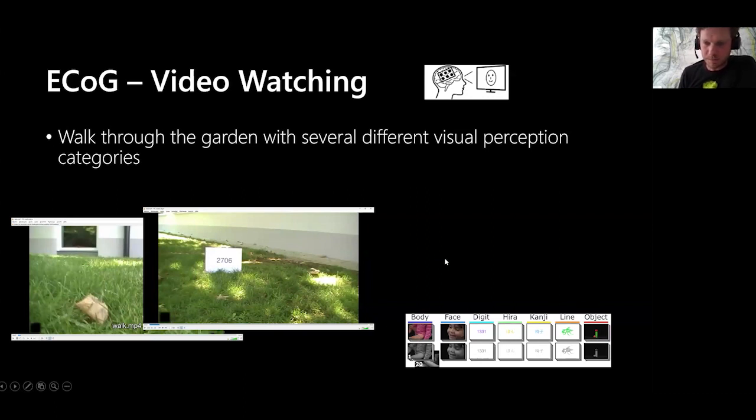That was an experiment also published, and you will get this publication, where the patient was really looking at visual stimuli, just showing those types of images in a controlled sequence. But this one is an extension of this experiment, where the patient was watching this free walk through the garden. Of course, you will also get the video the patient was watching alongside the data.